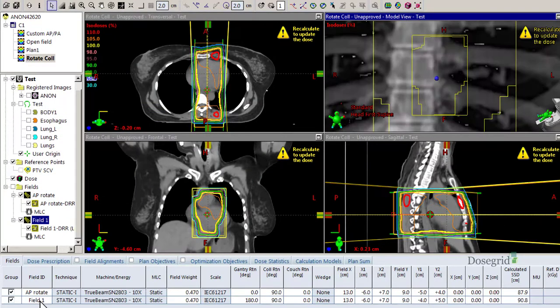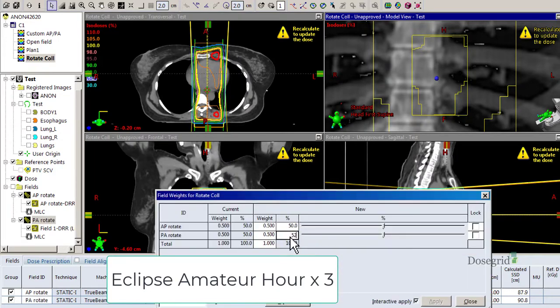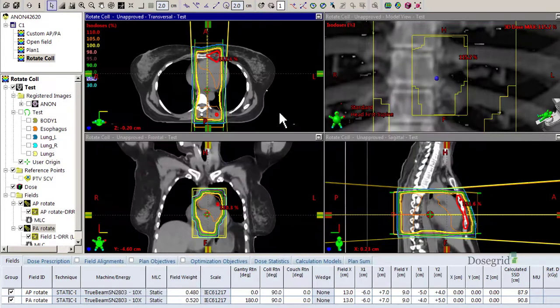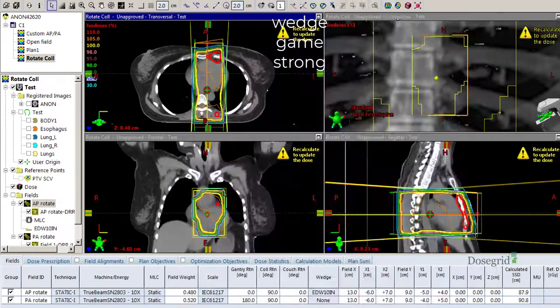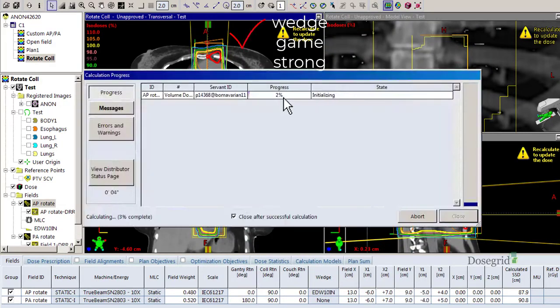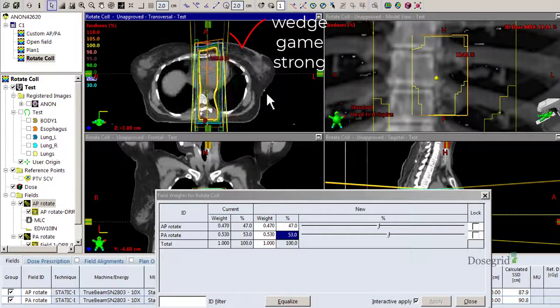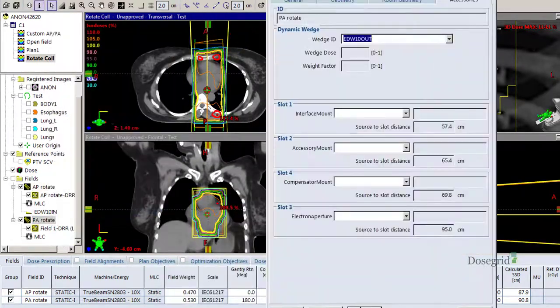Oppose the new fields rather than repeating for the PA, as long as the blocking was the same. Now you can wedge to your heart's content. And that's how to keep custom blocking after rotating the collimator.